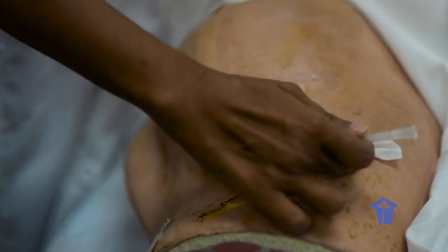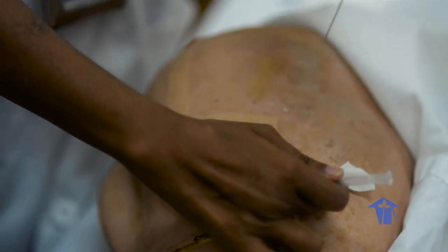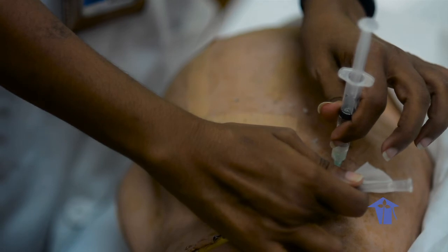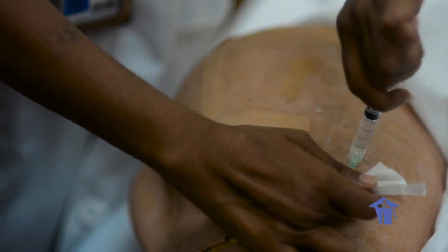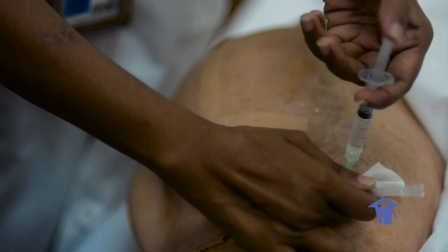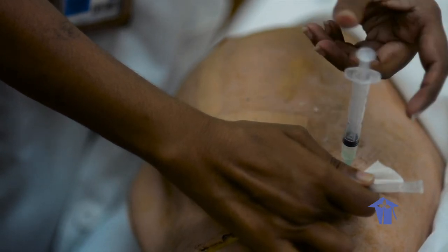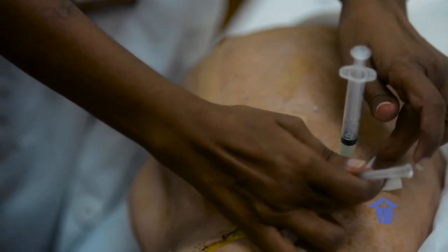Stick the needle into the tissue at a 90 degrees angle. My bevel is up, going in at a 90 degrees. Pull back on your syringe, making sure no blood is present. I've pulled back, there's no blood present. Once okay, inject the medication from the syringe into the patient. Remove the needle and apply pressure with a dry gauze.